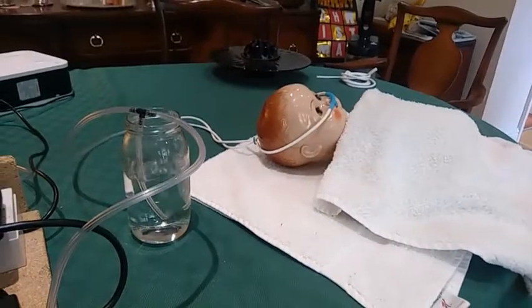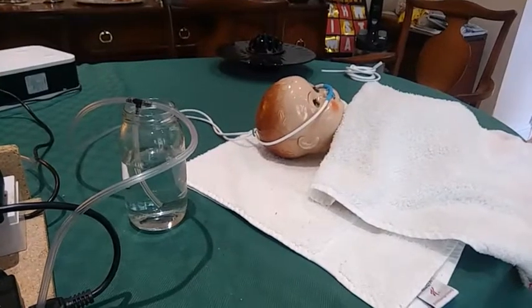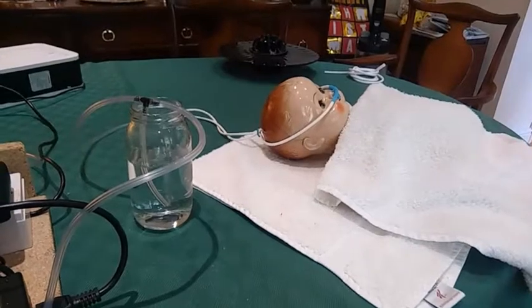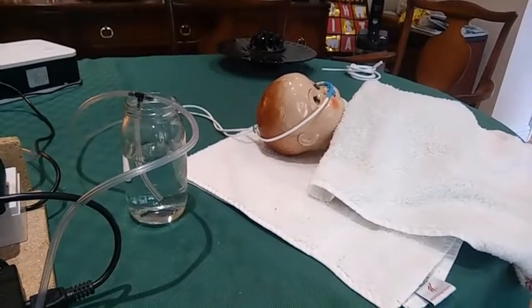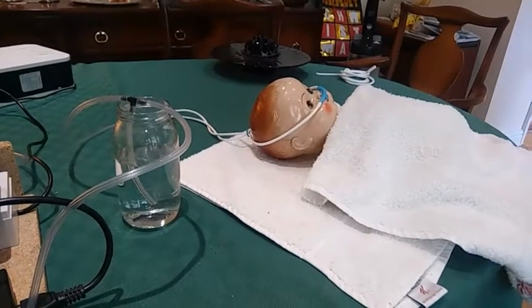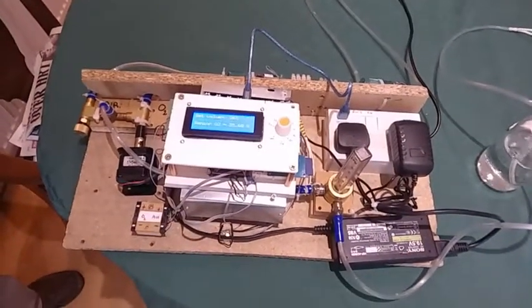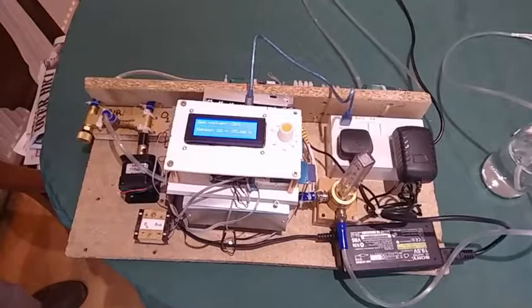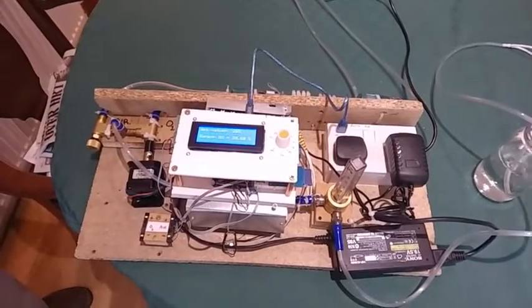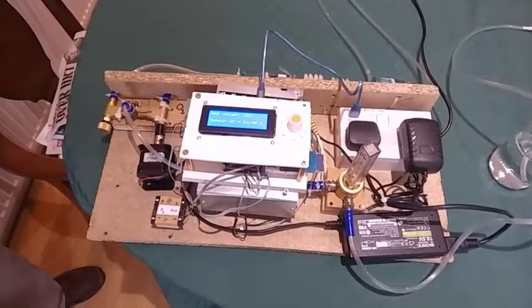This equipment allows good oxygen control in a low resource setting. Here we can see a neonate receiving nasal CPAP with nasal bubble CPAP. All this equipment is readily available over the internet. The level of control is better than in many Western high-resource units. The equipment can be put together by any technician with an understanding of computers.